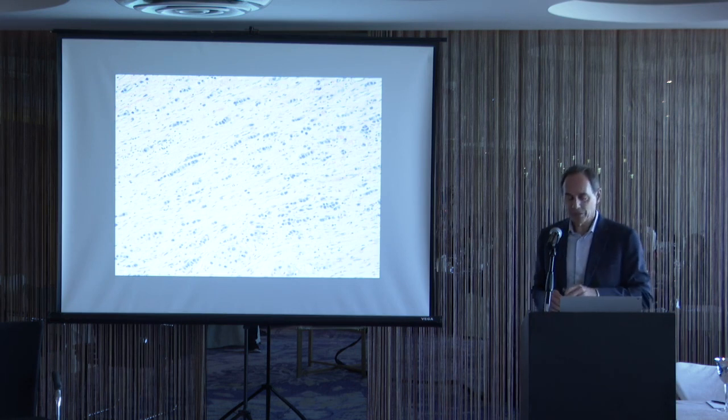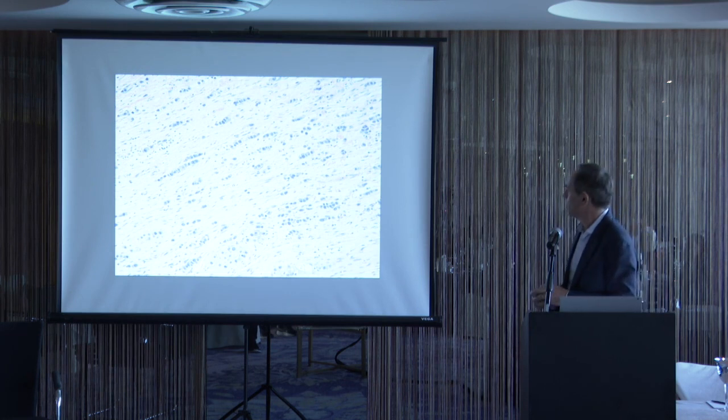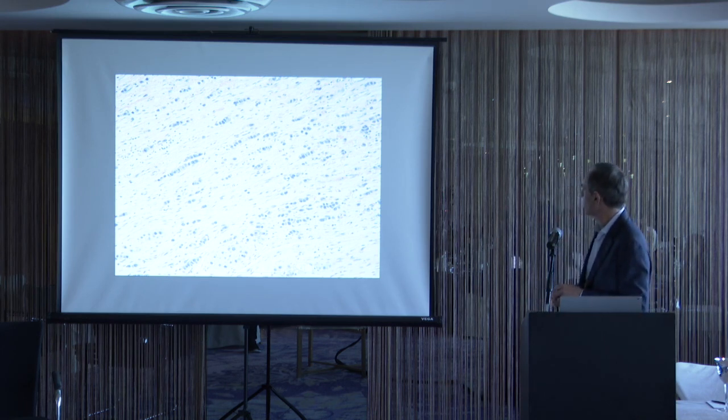Now, some of the patterns of seminoma that can also be somewhat confusing, if one has not seen them, is that seminomas, although they're usually just uniform, diffuse, loosely cohesive sheets of cells, can sometimes form little cords of cells like lobular carcinoma in the breast, looking more epithelial.